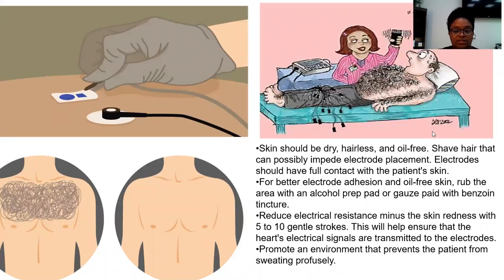And here is just a slide showing the placement of electrodes. And remember, I said the electrodes may look different depending on what facility you're at. So here's the one that looks different. And here's the type that we have here at the school.